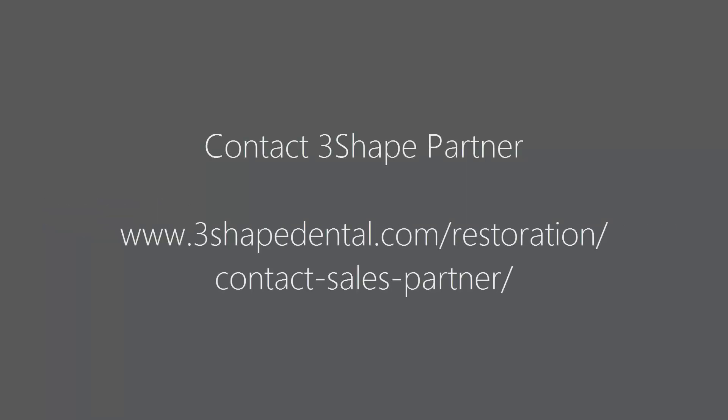Manufacturers and resellers can export materials and parameters as DME files through the dental system control panel. The same DME files can then be imported to your own dental system control panel. The imported material settings will then be applied to your designed restorations.